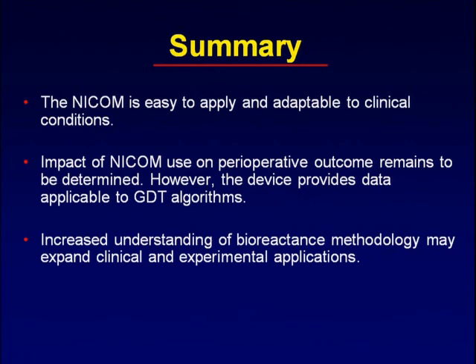Now, with our increase of understanding of the methodology and the expanded clinical and experimental applications, standing people on their head and being able to integrate this information with a variety of other physiologic variables, I think is incredibly profound. And the fact that you just put the electrodes on the chest, it's easy to do. I'm finding that the signal is remarkably powerful, and I really think we've only scratched the surface of what the potential applications of this are. And with that, I'll stop. Thank you all very much.